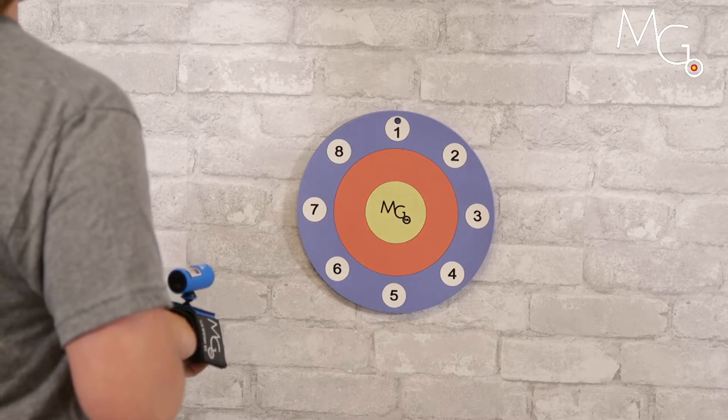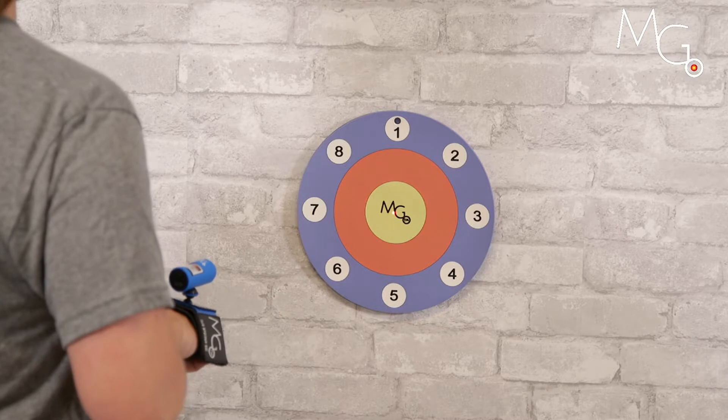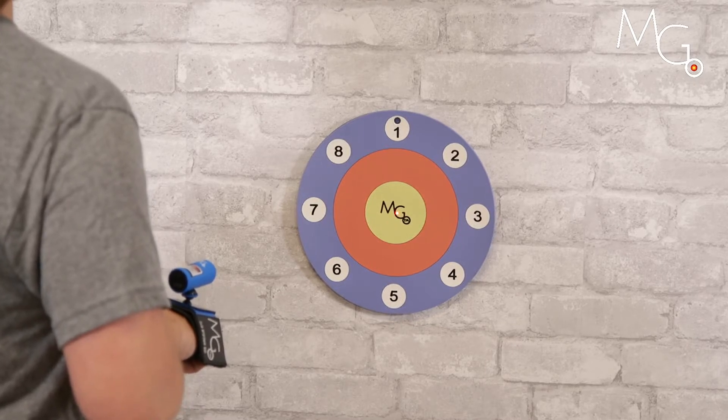Turn it off. Now bring it back down to where you think you're in the middle. Still a little low, but on the target. Let's try that one more time.